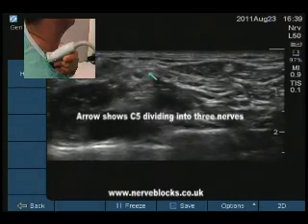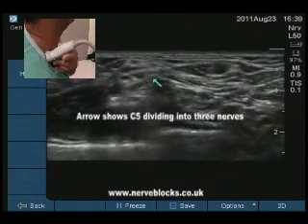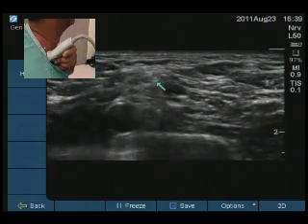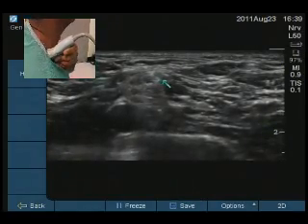3 parts, lines parallel to each other. Just show you that. 1, 3, 3, okay. Going down. Just to the right. Yeah, there it is.